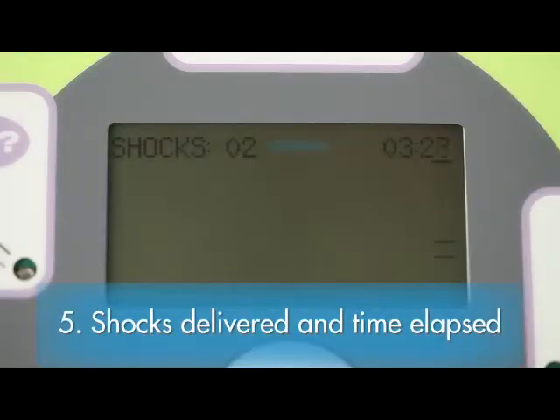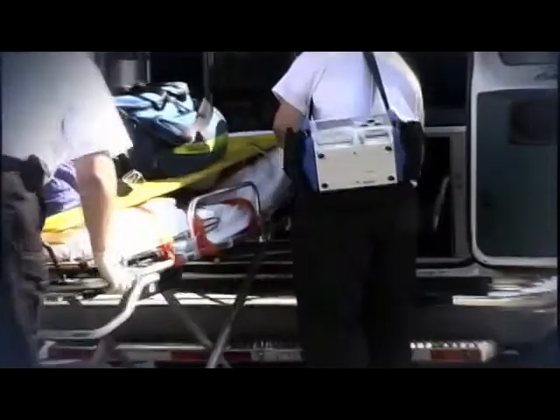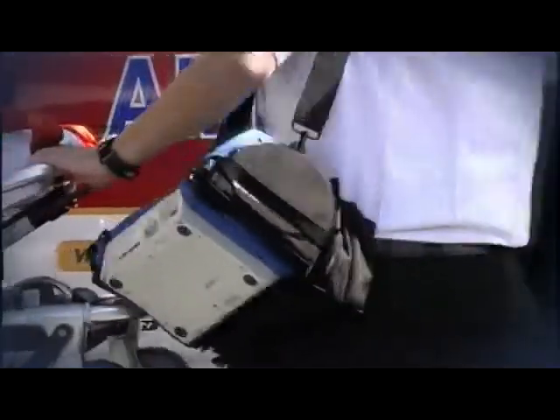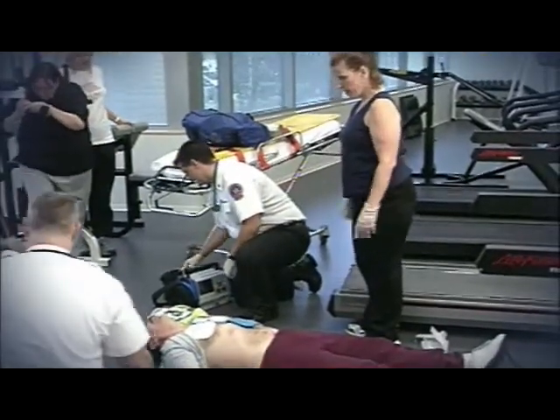Fifth element: at the top of the display screen, it continually presents the total number of shocks delivered and the time elapsed since it was turned on. This is most important because when the ambulance arrives, the medics will want to know both of these things, which could significantly affect what they do next.